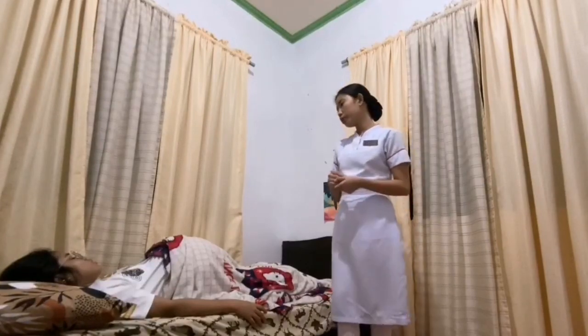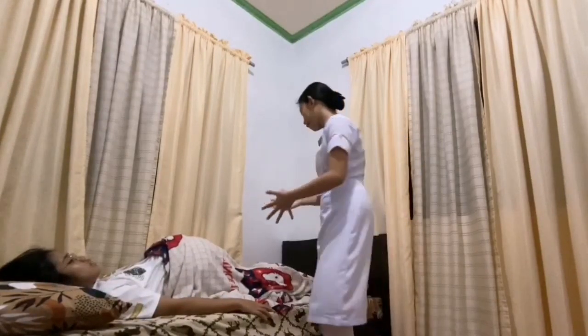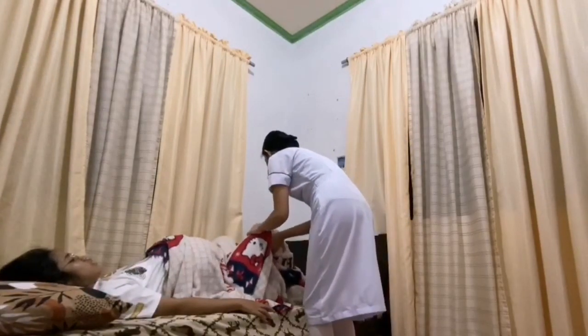So, for assisting in normal spontaneous delivery, the first thing that I am going to do is to ensure all delivery equipment and supplies are available and the place of delivery is clean and warm at 25 degrees Celsius. After that is to ensure the bladder is empty. So, ma'am, would you like to use the comfort room first? No, thanks. Okay. Assist the woman in a comfortable position. So, now I'm going to assist you to flex your knees po.